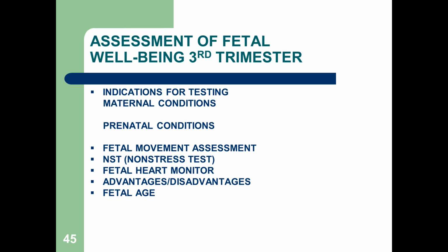So we will implement or use tests for fetal well-being to determine, is it better for the baby to be in or out, okay? Some prenatal conditions, certainly PIH, we're going to determine fetal well-being. If a mother presents to the clinic or the hospital and says, my baby hasn't moved in quite some time, we want to monitor for fetal well-being. And it may be as simple as doing fetal movement checks. However, we want to put them on a monitor and make sure they're okay.